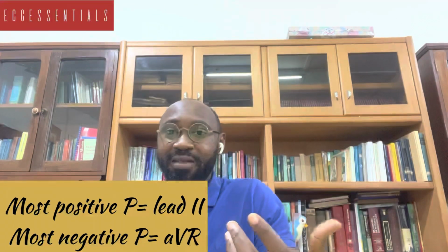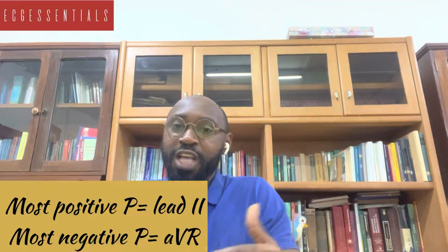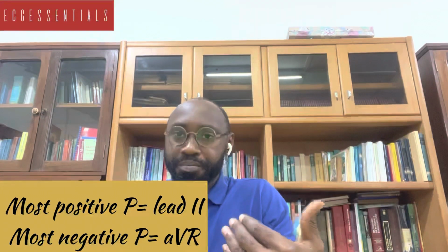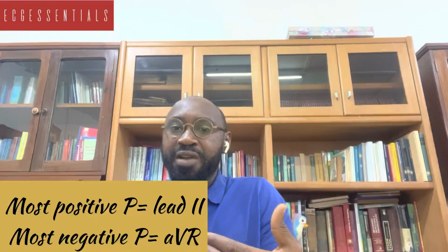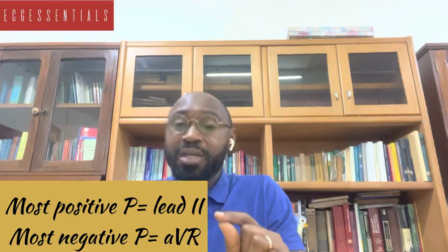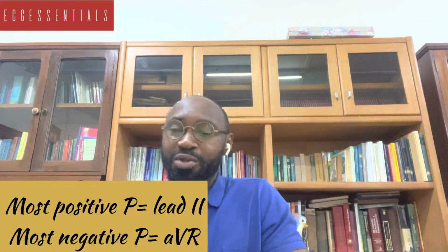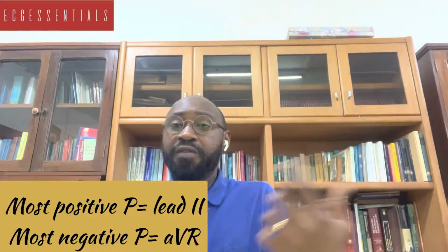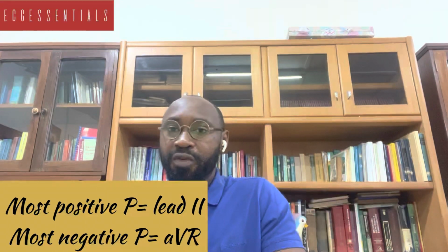We have discussed how the angle of orientation of lead 2 is around 60 degrees, and if the P wave is between 0 and 70 degrees, then it's understandable why in lead 2 we expect the highest amplitude of the P wave. And then of course AVR, which lies very far away, should record the most negative of P waves.